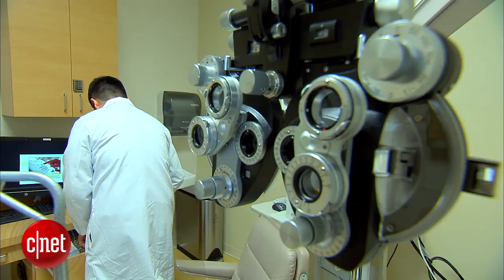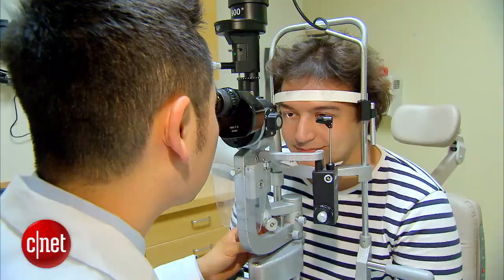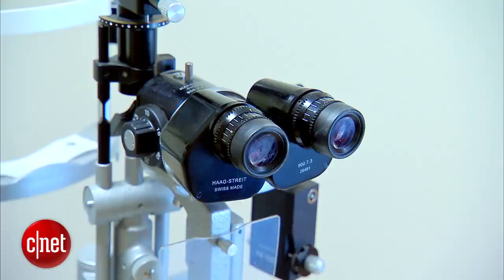If you've ever had an eye exam, you've seen these devices. I can see his retina now, his optic nerve, his macula, and his retina. To closely examine a patient's eye, doctors use indirect ophthalmoscopes and slit lamp instruments.